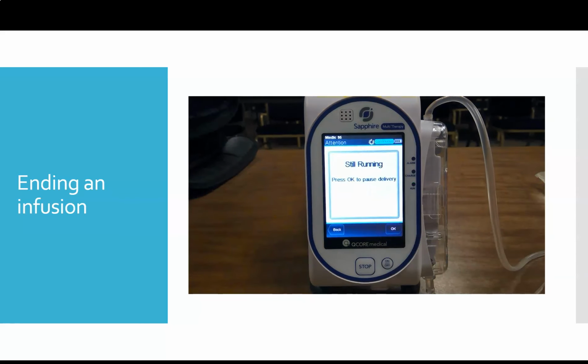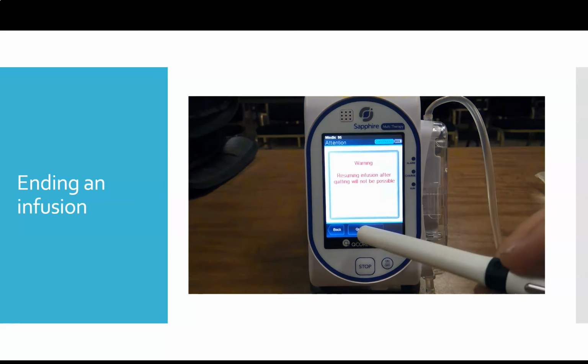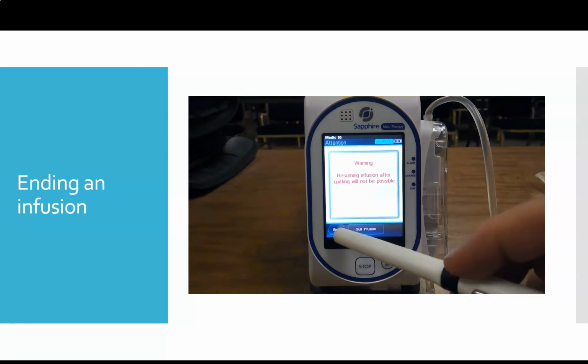OK to pause delivery. And then once it's paused, we'll be allowed to quit. You can't quit until you pause. It's going to warn you that it's going to stop.